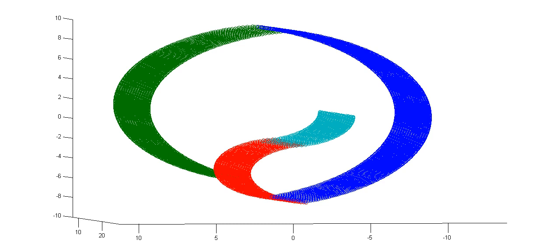So you could do this voxel-wise thing. An issue there, especially if you're doing brain-wide scans, is that you have a lot of voxels, and then you're doing a lot of comparisons, and in statistics, that's bad. If you do a lot of comparisons, you're likely to have false positives, so you're supposed to apply a correction to the level of evidence that you require to say something is different. It's supposed to be stricter levels of evidence to say that you found a difference when you're doing a lot of different comparisons.